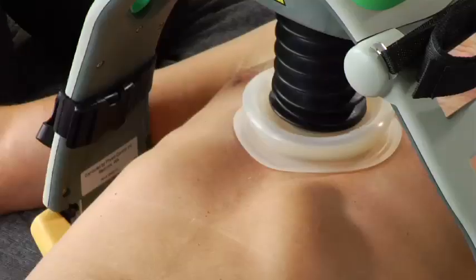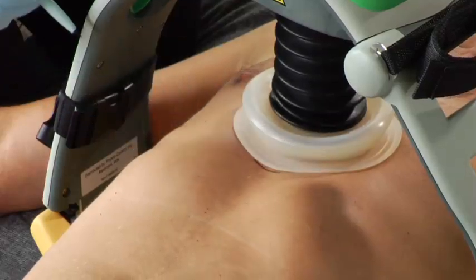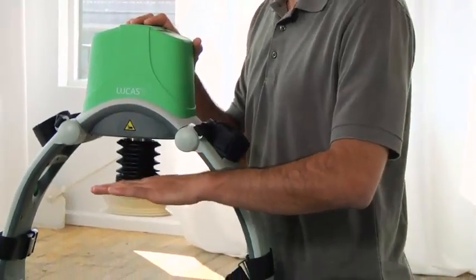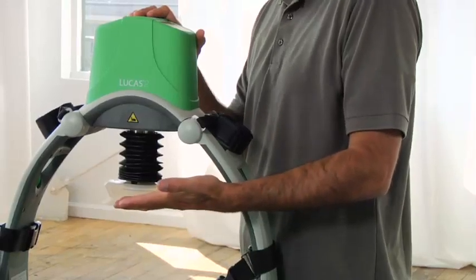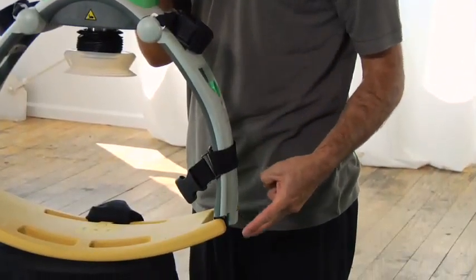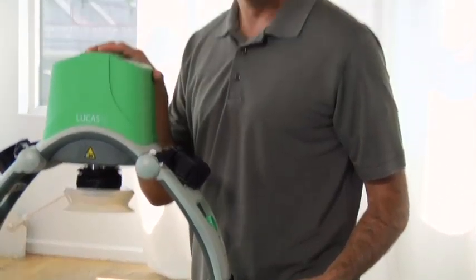When Lucas is operating, your fingers should not be on or below the suction cup. You can mark the right position on the patient's skin so you can easily see if the suction cup shifts and needs repositioning. From the set position, Lucas compresses down the same distance every time and returns to that position. If Lucas alarms with three fast signals when you try to enter pause or active mode, the patient is too small and it cannot perform a full compression. If you can't get the upper part around the patient and secure the claw locks onto the back plate, the patient is too big. Do not try to use Lucas on a patient that it doesn't fit — it won't be effective. In that case, continue manual compressions.